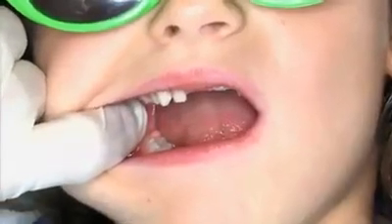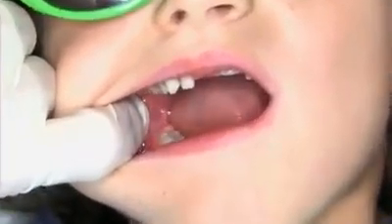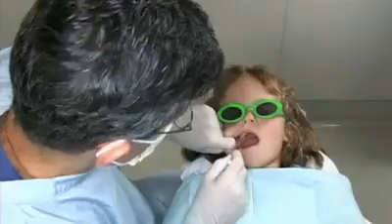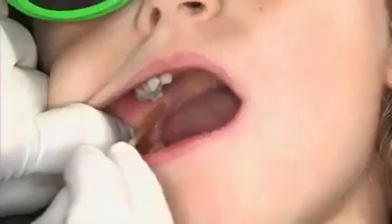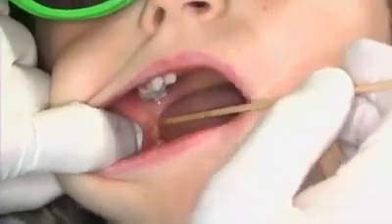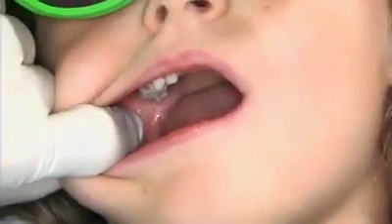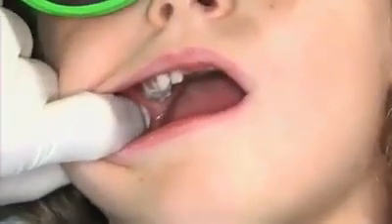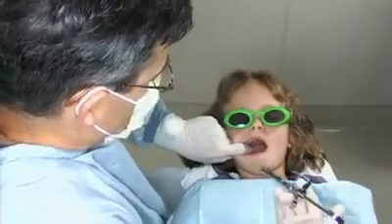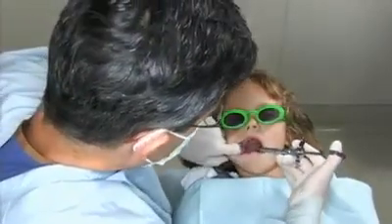To locate the deepest portion of the coronoid notch, which determines the height of injection. The pterygomandibular raphe is visualized and the internal oblique line is palpated just lateral to the raphe to determine the point of injection. If this structure cannot be palpated, it is assumed to be directly lateral to the raphe.